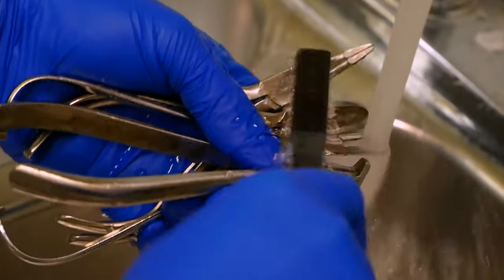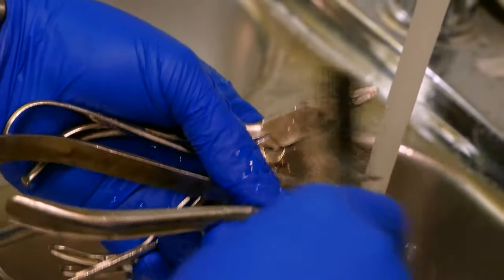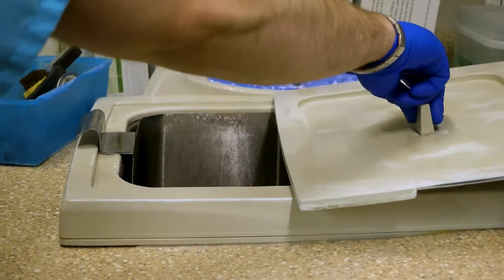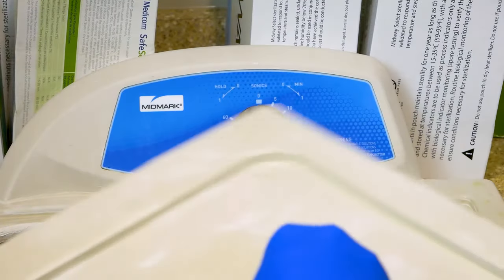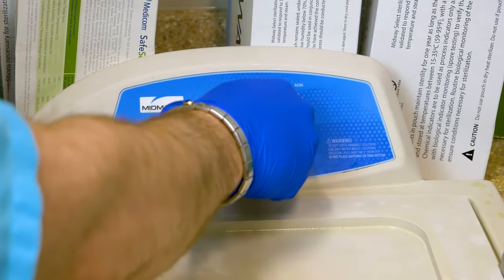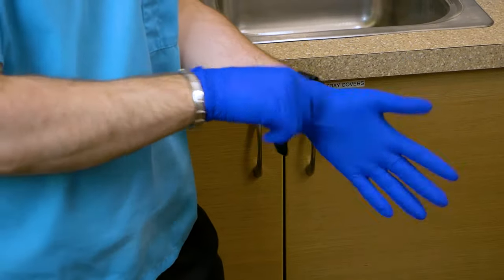During this step, the sterile tech will also use a brush to remove any debris from the instruments. Next, the sterile tech will turn on the ultrasonic and place all the tools inside. The timer will be set for 10 to 20 minutes. The sterile tech will switch gloves at this point to ensure that the instruments are not recontaminated.